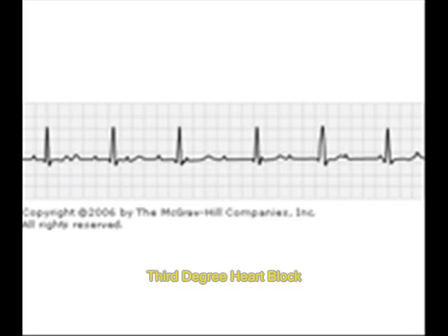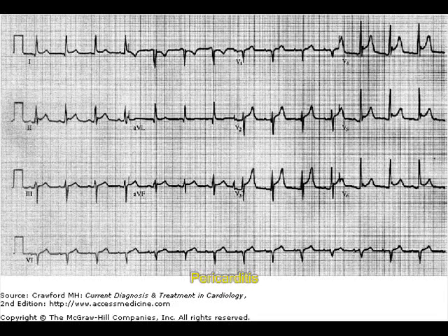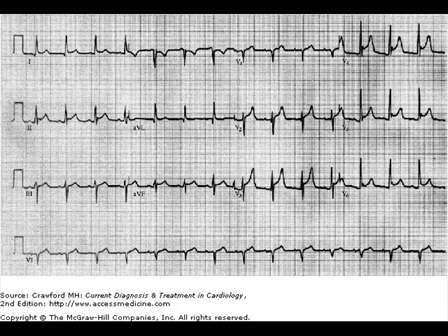And now you can see this is 3rd degree AV block. Both atria and ventricles contract differently — this is 3rd degree AV block. Now let us go to see some others. This is pericarditis. In pericarditis, you see diffuse ST segment elevation. You can see ST segment elevation in almost all leads, and the voltage is also less. This is characteristic of pericarditis.